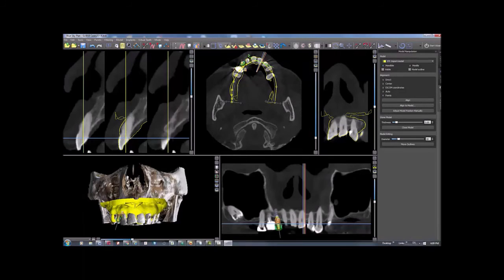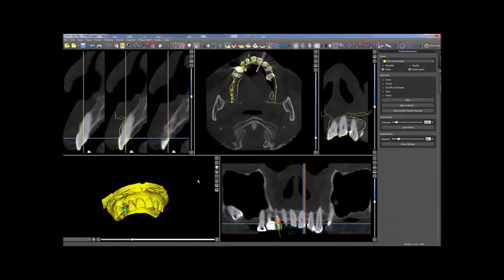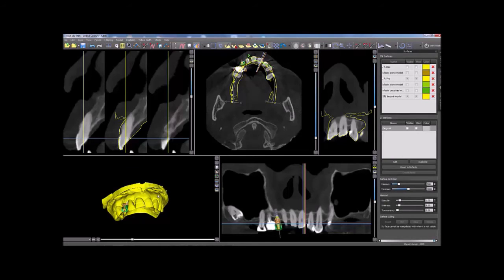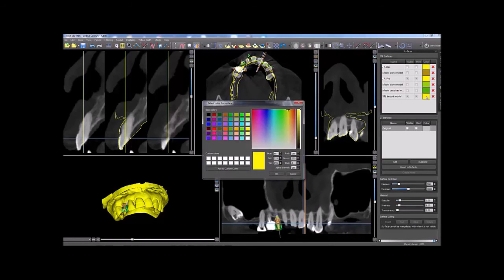The 3D view will display the models aligned together with the CT scan. For clarity, the CT scan surface has been shut off. Additional functionality can be obtained once the model is imported — double-click on the model to open the Surfaces panel. Click on the visibility checkbox to toggle the model on or off. Click on the hint to show the outline of the model against the 2D scans in the cross-section, axial, and tangential views. Click on the color in order to modify the color settings.